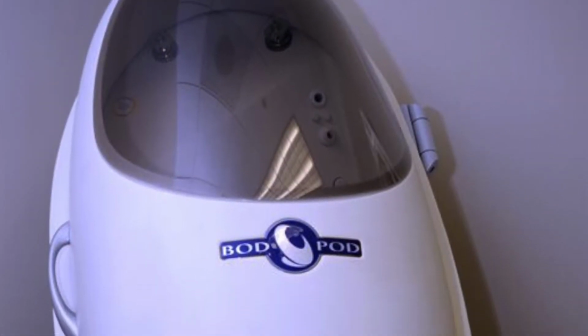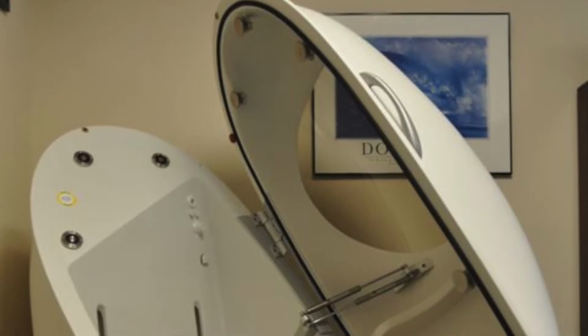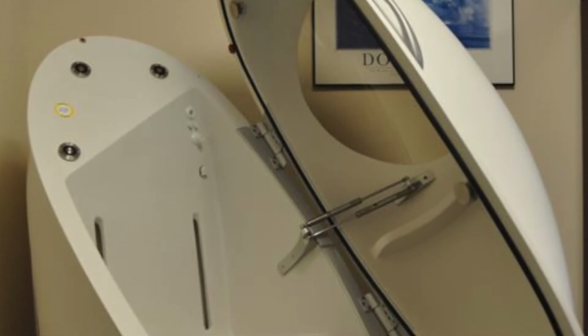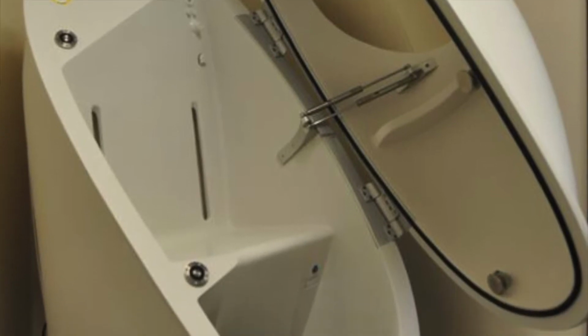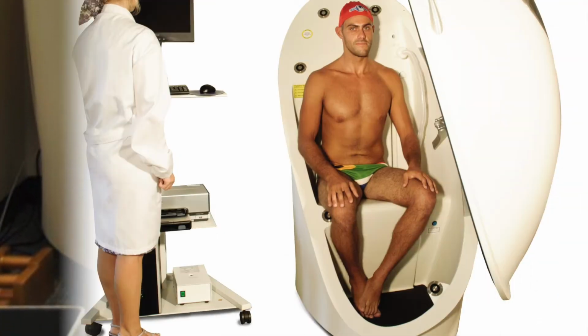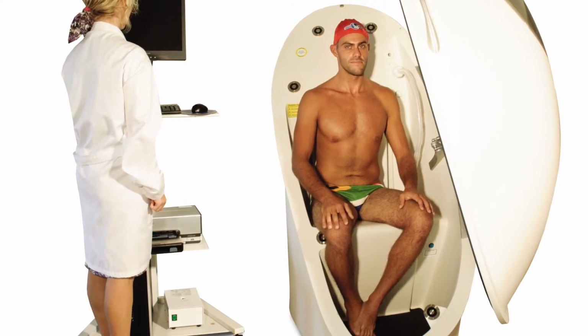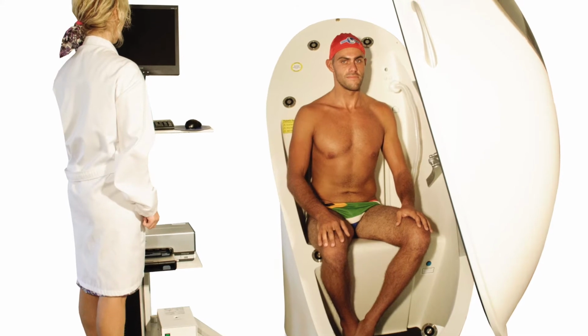The only commercially available product that uses this technique is called the BodPod, made by Cosmed, and previously Life Measurement Instruments. This device has two chambers, one for the patient to sit in and another in the back that is not visible for reference pressures. Physiologically, this technology measures percent lean versus fat by measuring human body volume.